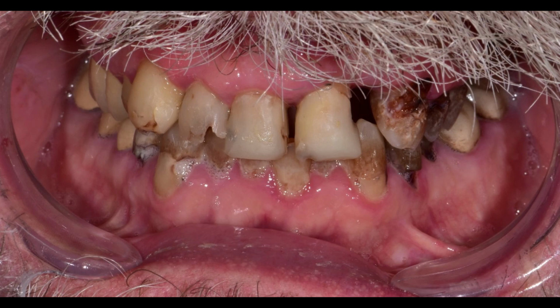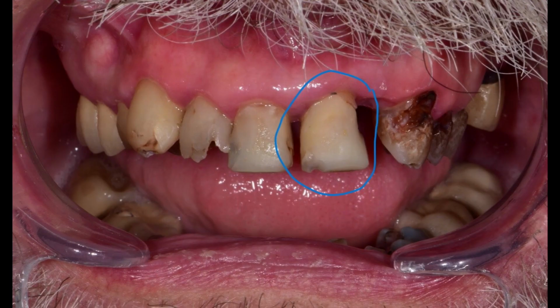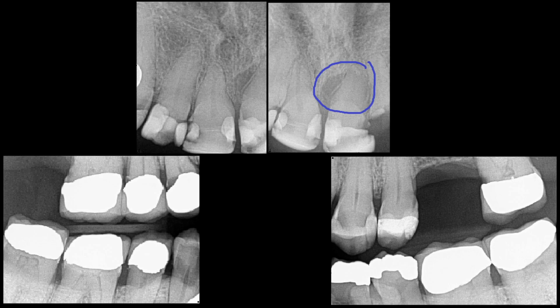This is a patient that came to the clinic complaining of pain in his front tooth. It turned out that the tooth circled in blue was responsible for the pain. And when we take an x-ray, we can see a large lesion around the root tip indicating an infection. There's also a retained root beside it.